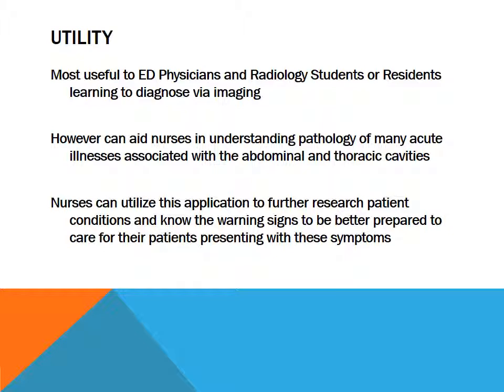This application is mainly geared towards ED physicians and residents, as well as radiology students or residents learning to read CT images and diagnose them.